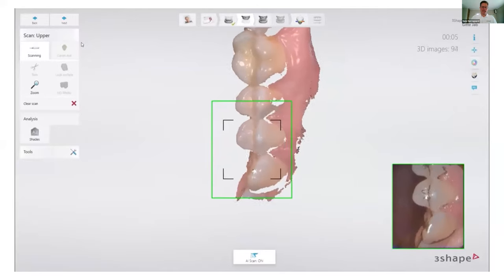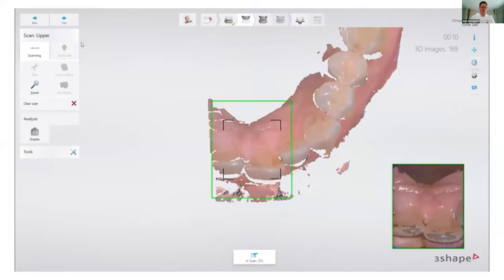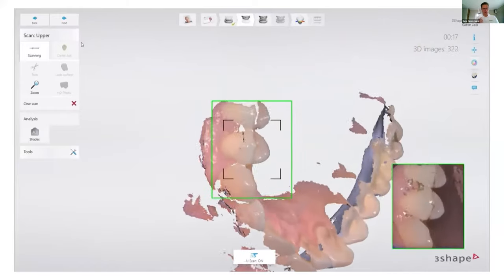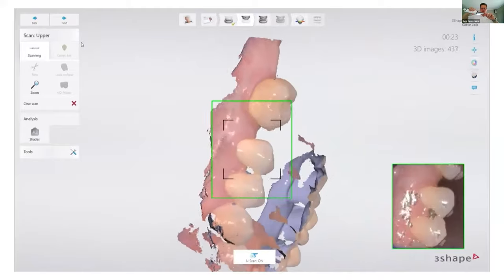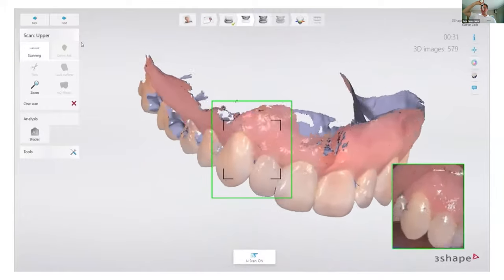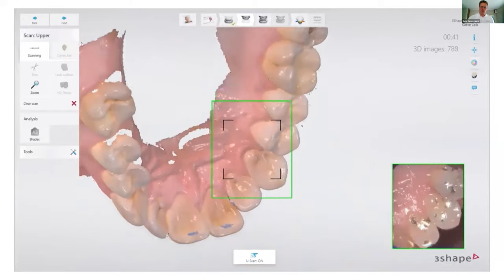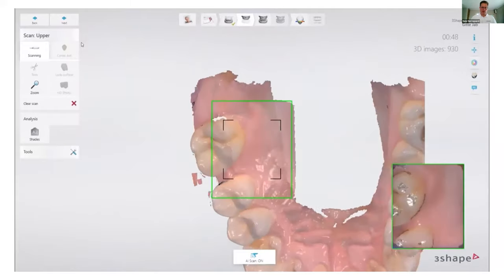We start at the top of the big molar to capture a lot of the detailed data here, because if the scanner stops, then we can always go back and continue from there. We get to the front, and here again you see a little bit of wiggling, and you should think of it as quite a lot. When you have the scanner in here, the mirror is pointing at a certain angle. So you need to do a wiggle where you put the scanner quite high and also quite low. If you start in the back and aim for the tip of the nose, then do the wiggling and go to the back, you will have scanned a really good arch that is a good reference for the rest of the scan.